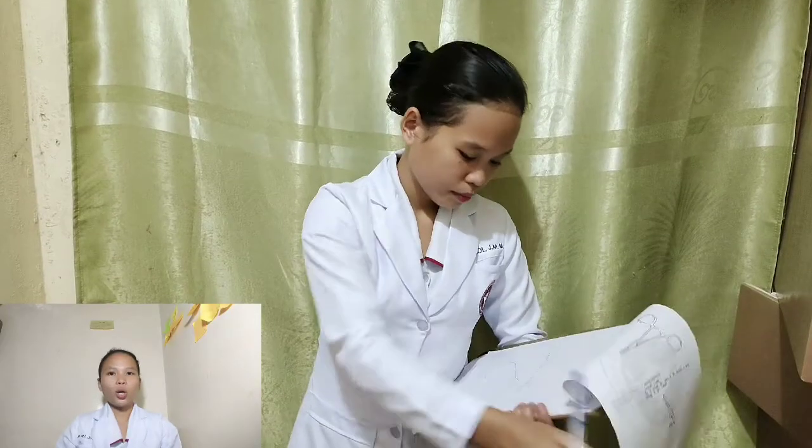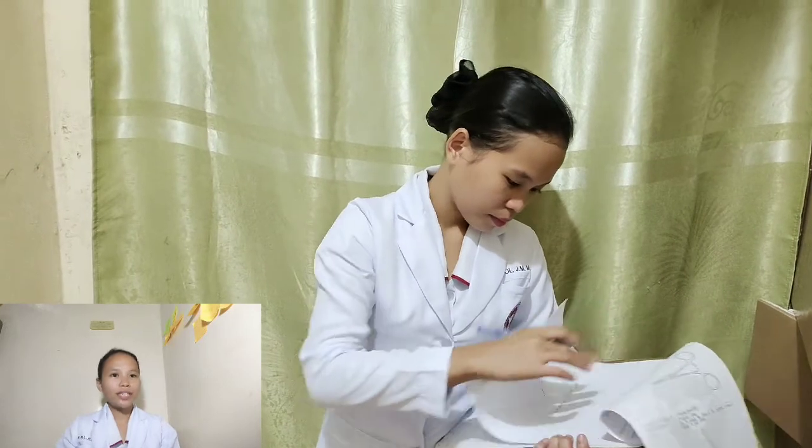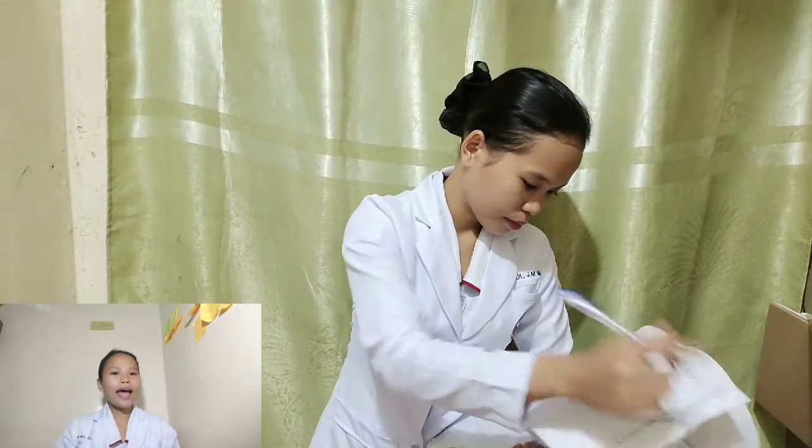Step-by-step process of the procedure. First, check the doctor's order and make an IV label to ensure that the client receives the correct IV solution and medication as ordered by the physician. Wash hands to deter the spread of microorganisms.